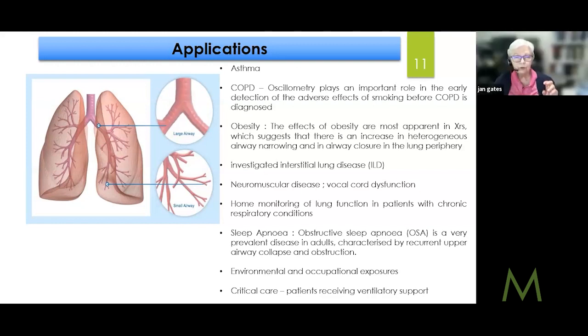Okay, and so your normal is based on a sample size of what? We have a sample size of 300 adults. And do we know if it's different in India versus a polluted place like the US and Chicago? We do not have the information from the US, but we have compared this with European data. It compares well. We have published a report, so I can share that.